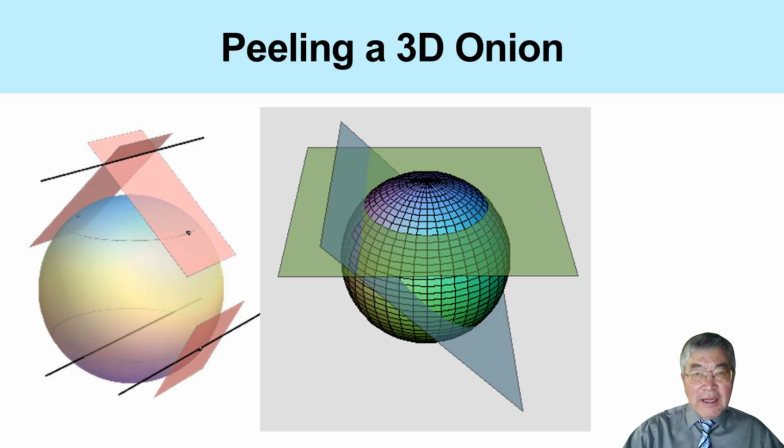So we begin from the outermost shell. A tangent plane touches the object in a very small region, ideally at one point or one voxel on the boundary. Therefore, the corresponding planar integral gives us direct information about that outermost voxel or shell element.